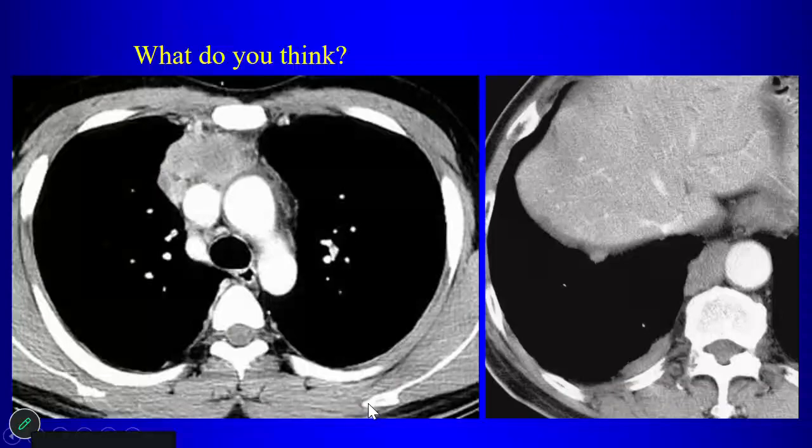Here again, there's an anterior mediastinal mass. There's another finding here that really helps you in terms of what this might be. What's the other finding?